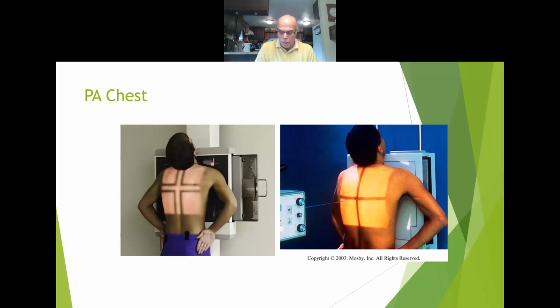The appropriate kVp will penetrate the mediastinum to show a faint image of the spine, as well as demonstrate the pulmonary vascular markings. Remember, we talked about the lung markings in the lung field. That's when you know you have made a good exposure. It's the same idea as when you were doing bone work, where you're looking for that bony trabecular pattern, but here it's called vascular markings within the lung field. When you can't see that, your exposure was not correct, or there may be a pathological condition that's obscuring that view.